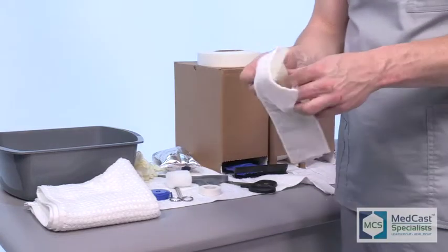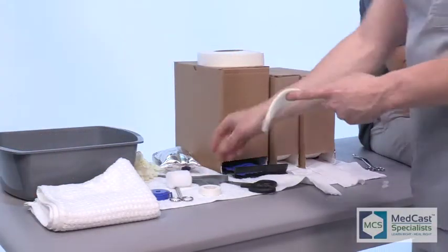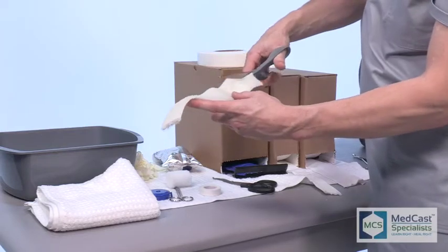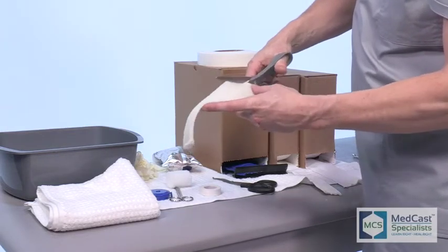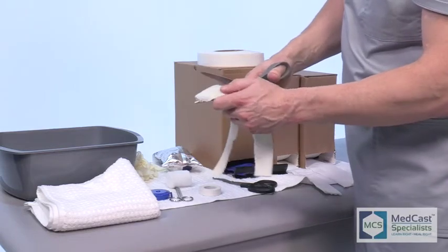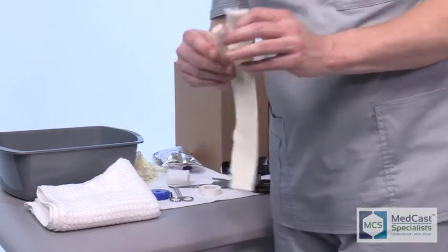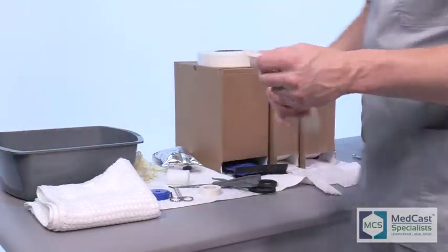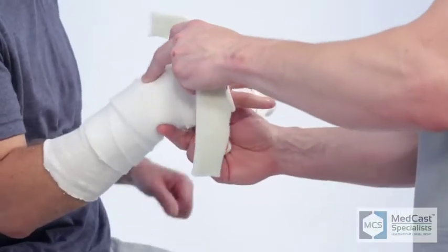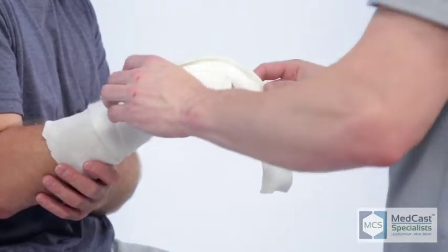I'm taking the 2-inch splint material and cutting about a 1/2 inch off of it. We're going to put it on the dorsal side of the patient. If you have a patient that you have any concerns about, like a younger kid or somebody that's more active, you can actually place one on the dorsal and volar side to give it a little more strength. We found that just one strip will usually be enough strength. We have used 2 many times, but when you do that, it often makes your cast a lot more bulky. Patients really appreciate when you can reduce bulk on these.